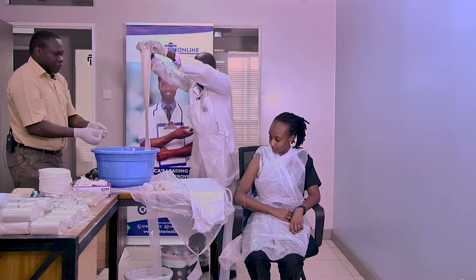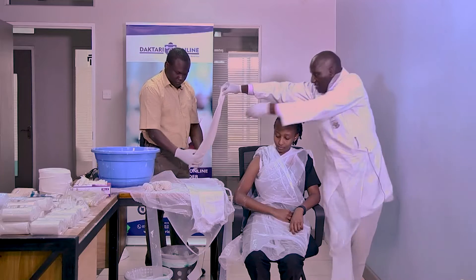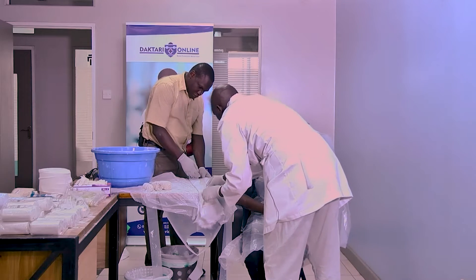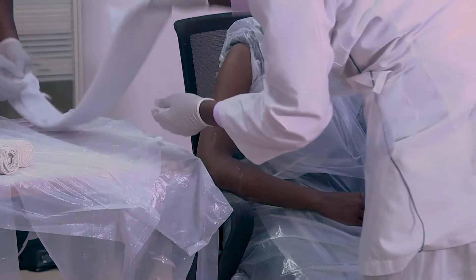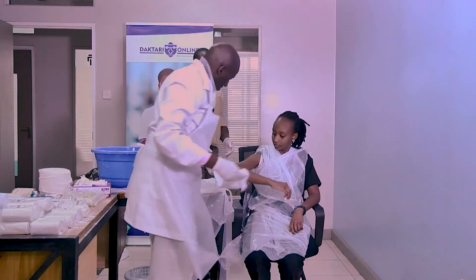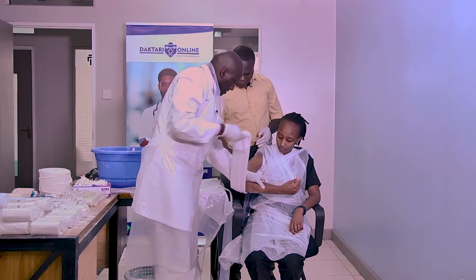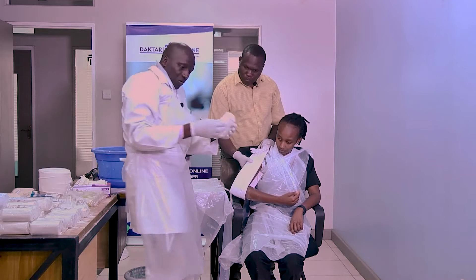Then my assistant holds that part and I'm able to hold this side. So we are able to spread our slab and fold it on both sides. Ensure you cover well, then bring your slab into position. Make sure you don't dig into the axilla. Your elbow should be at 90 degrees. I have my assistant there, and we secure with a crepe bandage.